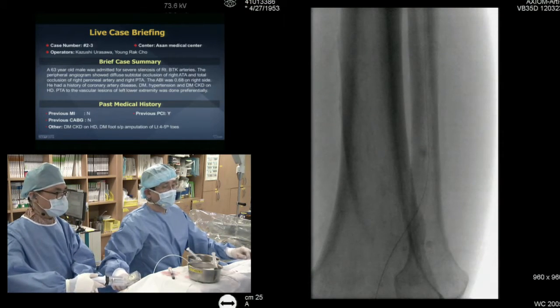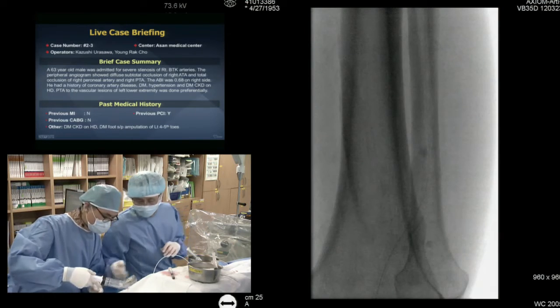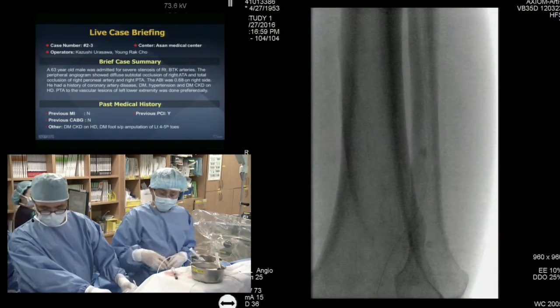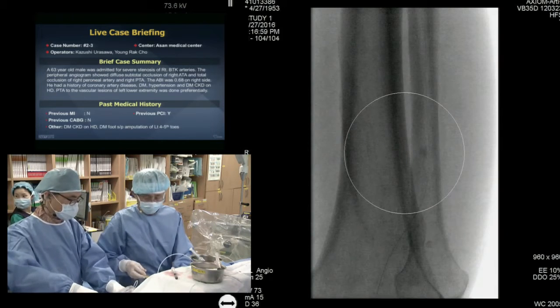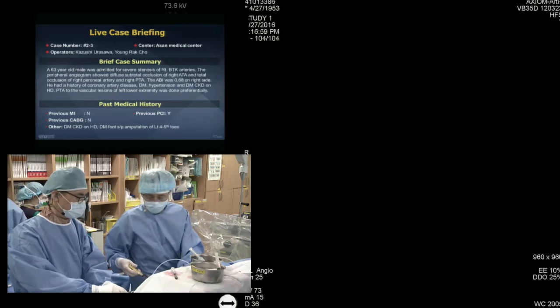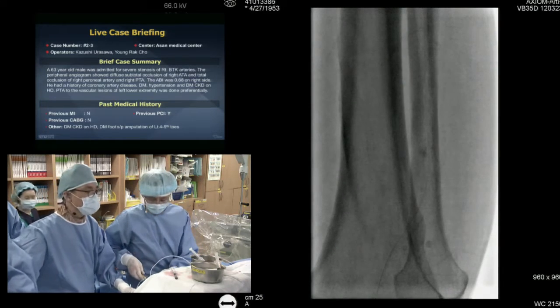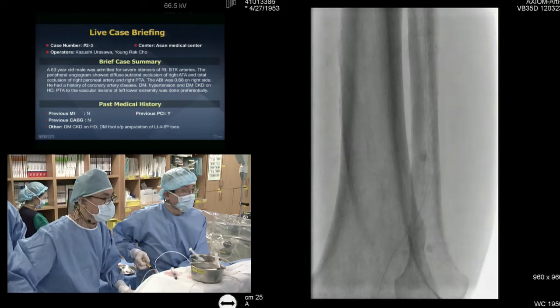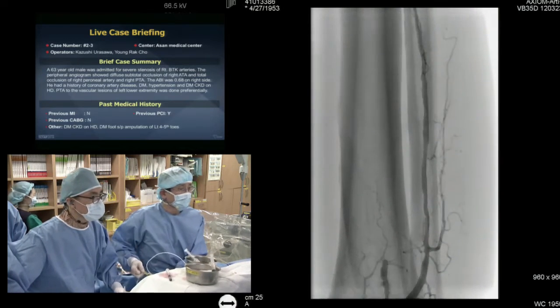So can I have the cine mode, please? DA mode, cine mode. Coronary mode, please. Lawrence, in cases like that, would you consider atherectomy for these kind of cases in the U.S.? So I was going to ask Sensei this, you know, there's this interest in the U.S. about this kind of plaque remodeling.